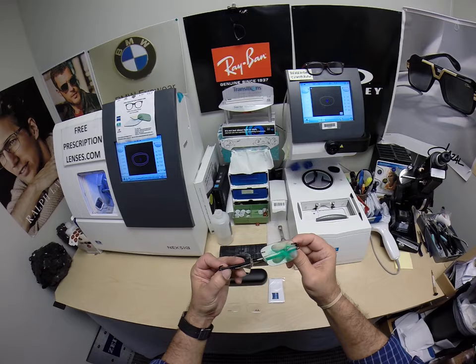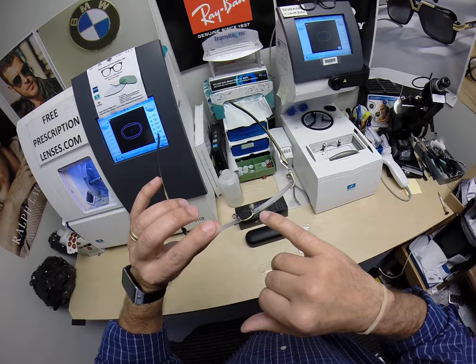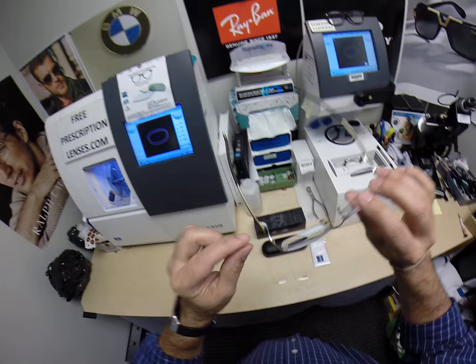It is model number 5126. It is a drill mount frame, meaning that there are literally drilled holes in the lenses to mount them into the frame. Great frame here. Very unique hinge design, which is the built-in spring hinge.